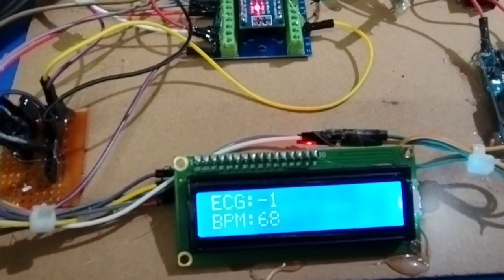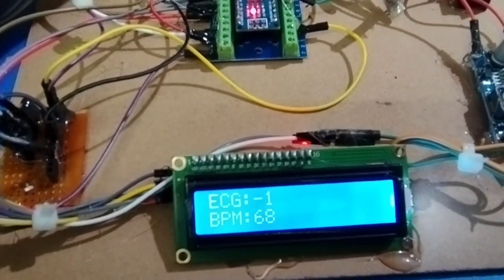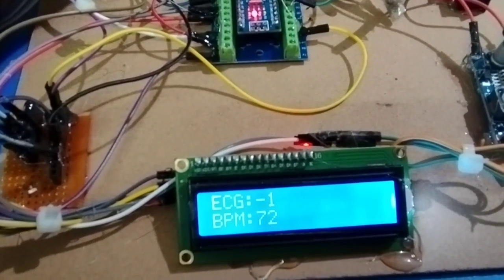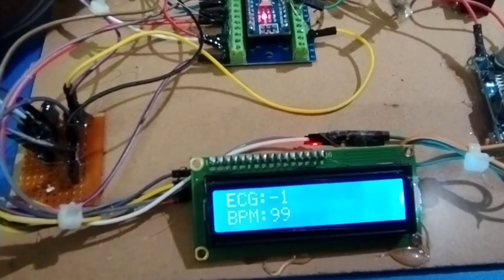Yeah, now we are getting the exact data. The BPM is around 60 to 68 to 72 for him.